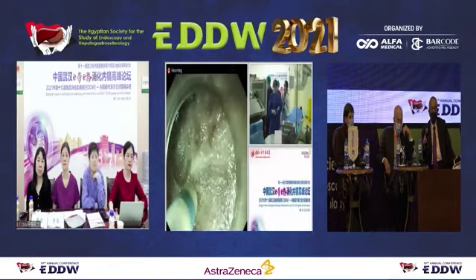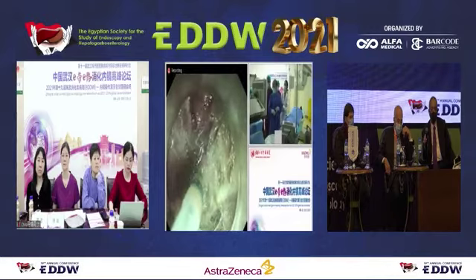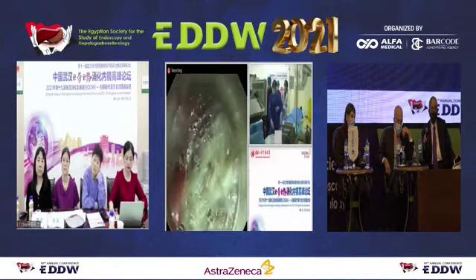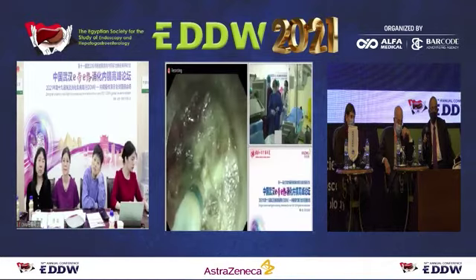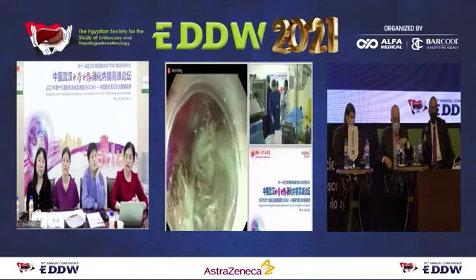So Professor Wang, now do you use coagulation or just cut mode? When we do the myotomy, we usually use the coagulation mode.